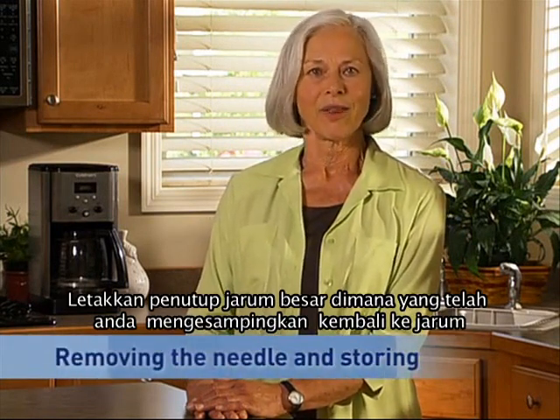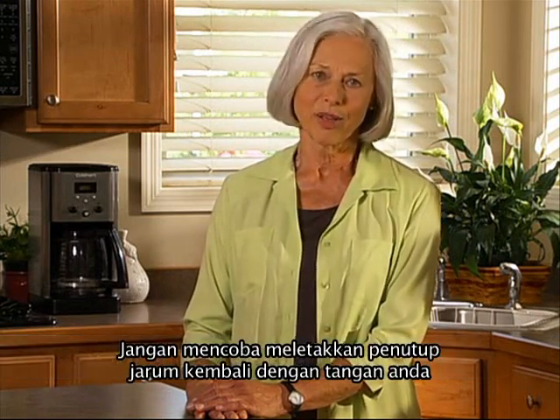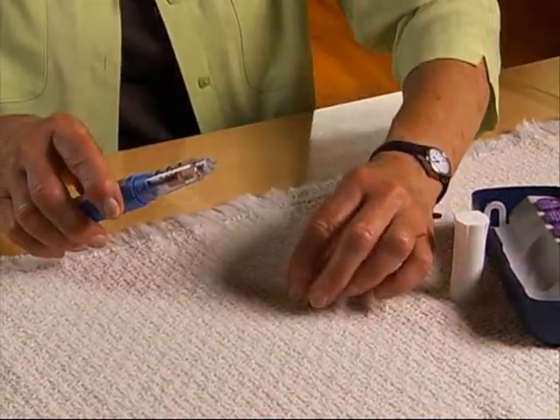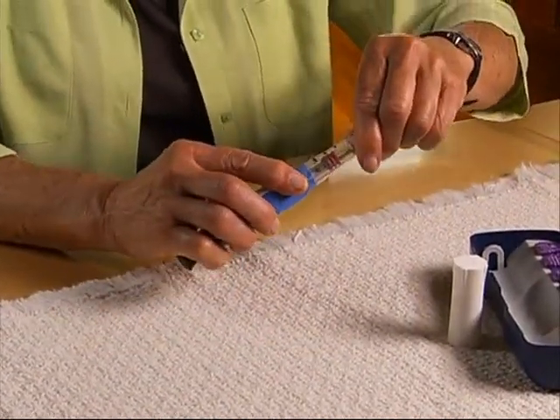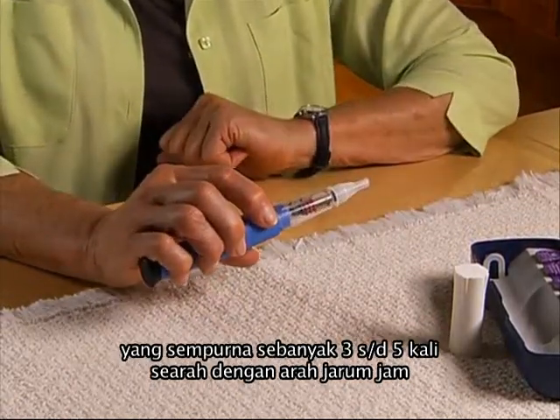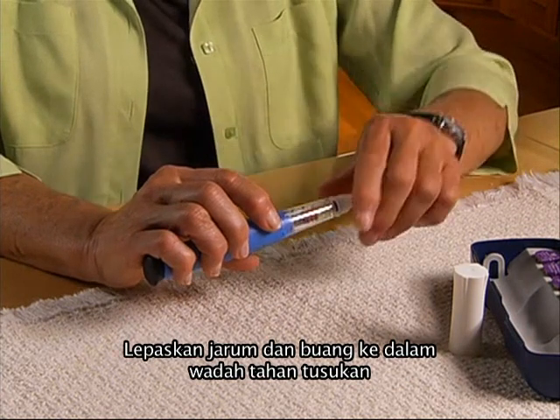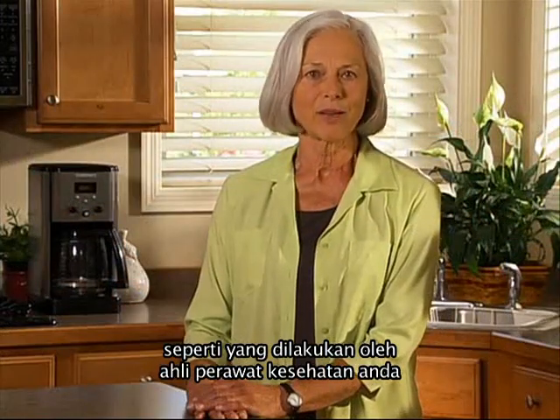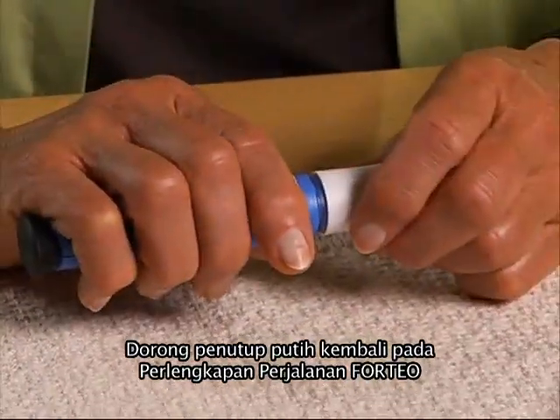Put the large needle cover that you had set aside back onto the needle. Do not try to put the needle cover back on with your hands. One way to put the cover back on is like this. Unscrew the covered needle all the way by giving the large needle cover 3 to 5 complete turns in a counterclockwise direction. Pull off the needle and throw it away in a puncture-resistant container as directed by your healthcare professional. Push the white cap back on your Forteo delivery device.